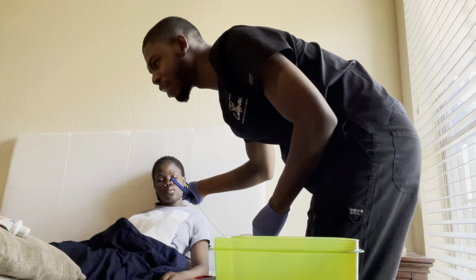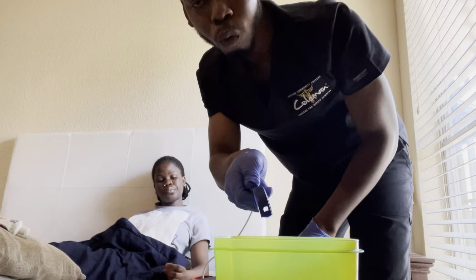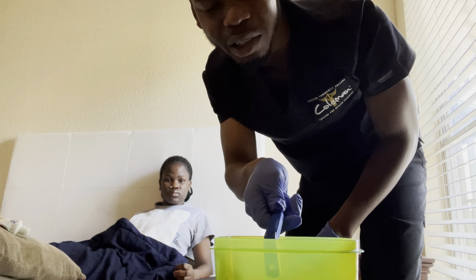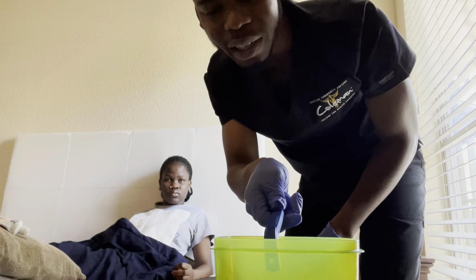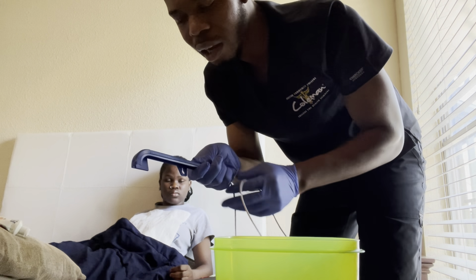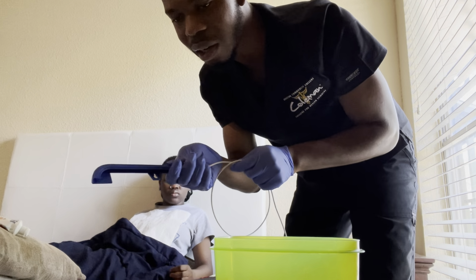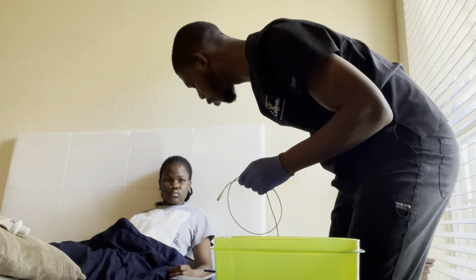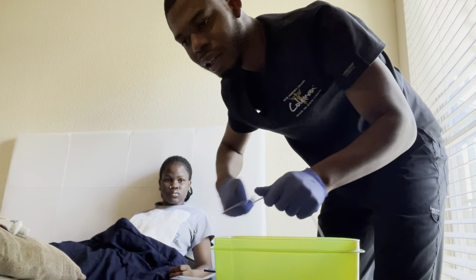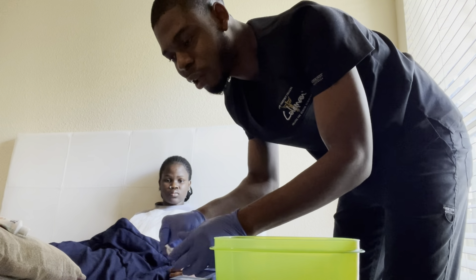Now that I'm done, I will take out the Yankauer catheter away from the patient's mouth and I will suction water through the catheter into the suctioning tubing in order to clear the suctioning tubing of all the secretion that are collected from the patient's mouth. When I'm done with that, I will remove the suctioning tubing from the end of the Yankauer catheter. I will turn off the suctioning machine and I will fold the suctioning tubing into a plastic bag or into any bag to store in a cool dry place.